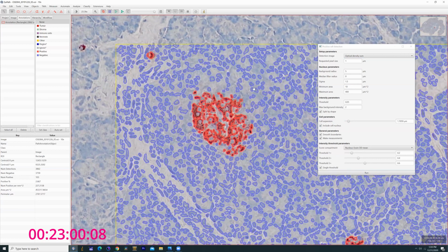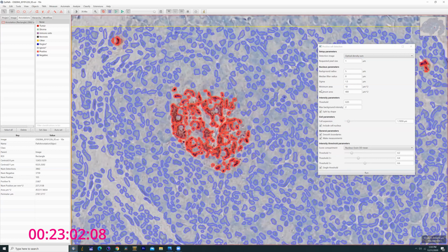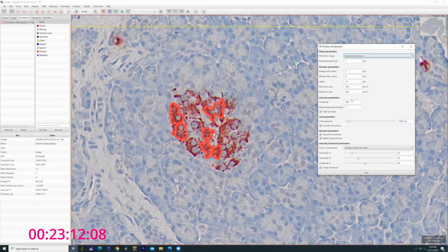clarify where the centers are, the nuclei are, and this is doing an okay job. One of the things you can do is you can specify the minimum surface area of that nuclei. So if you increase that nuclei size too large, it'll actually eliminate a possible reference.